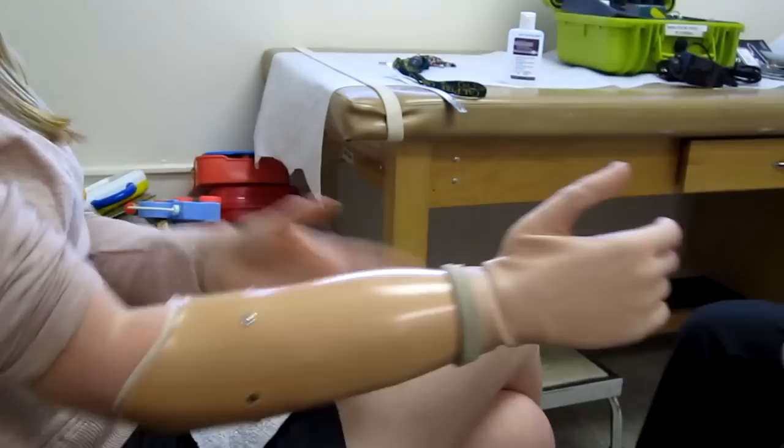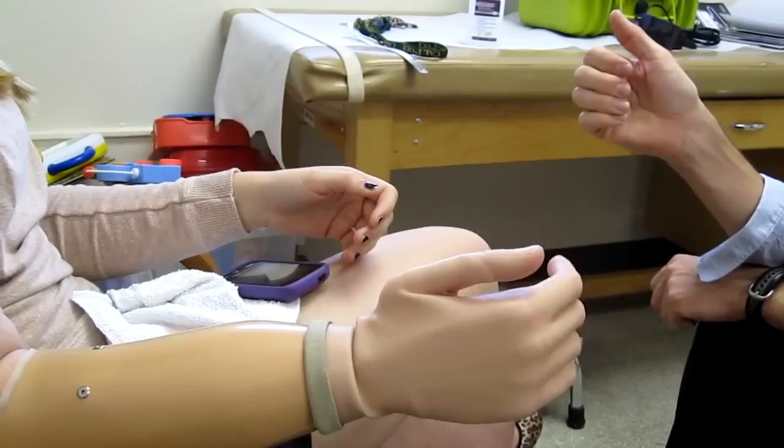So now close the fingers this way — just all the way close the fingers. All the way. Keep going. Keep going. Okay.